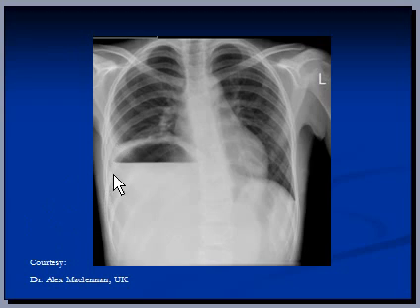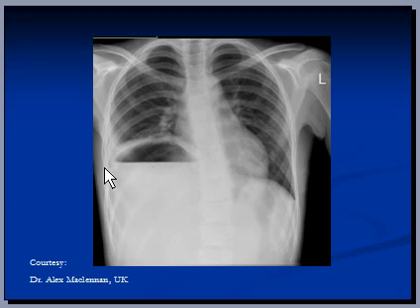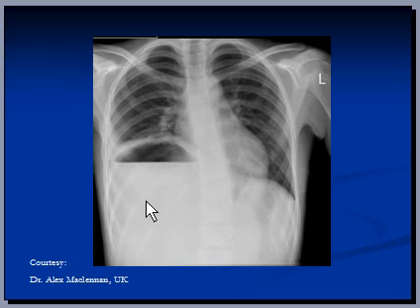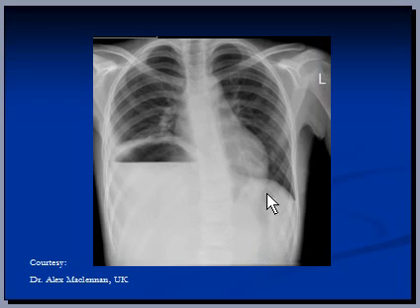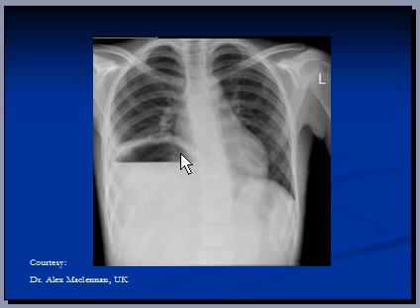Number three: notice there is an air density just below the right hemidiaphragm, and also there is a sharp horizontal flat line. Air density under the right hemidiaphragm is never normal. You normally see air in the stomach or in the colon here, but air density under the right hemidiaphragm is never normal because this space should be occupied by the liver.